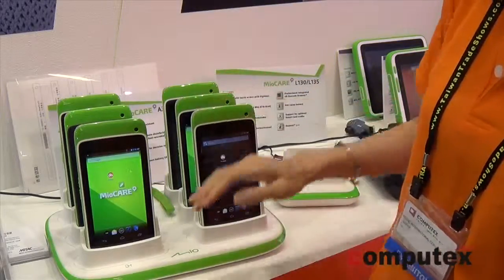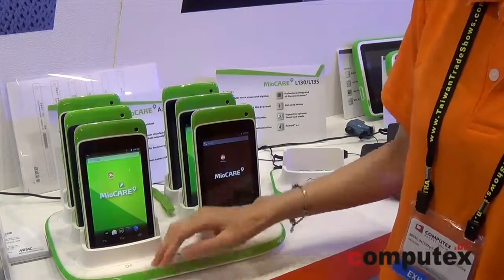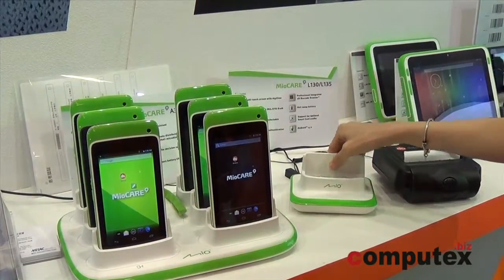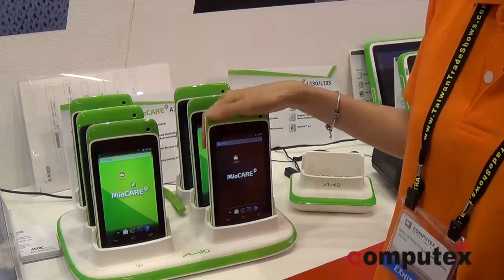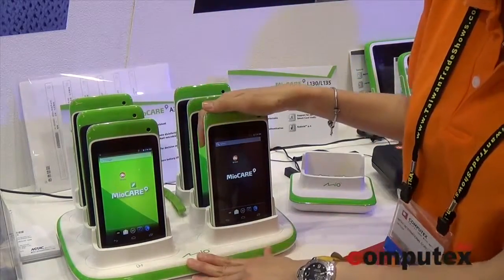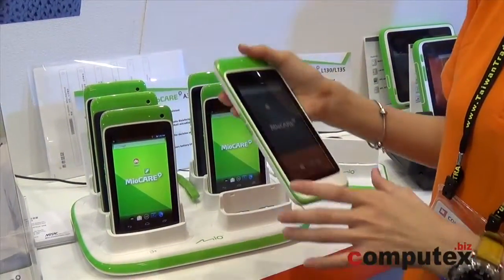We also designed the cradle for the working station — a six-unit cradle and also a one-unit cradle. So once your nurse is very busy, you just plug out and plug in for charging and also for data transmission.